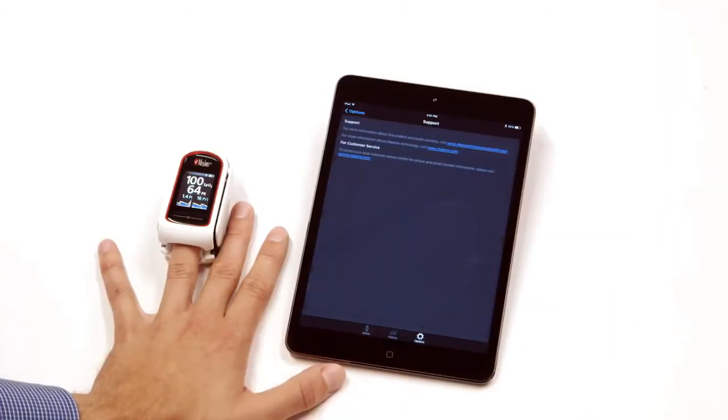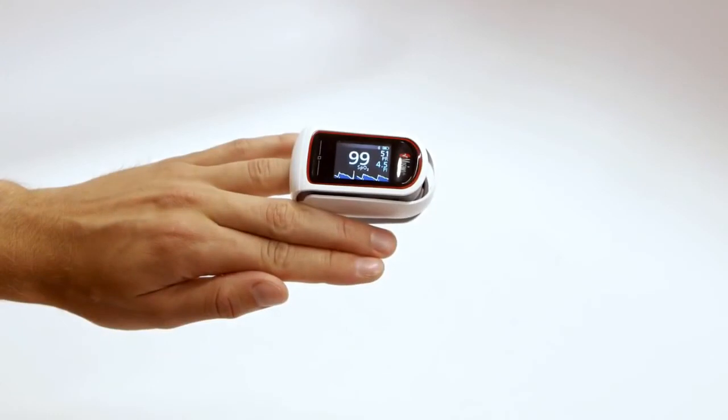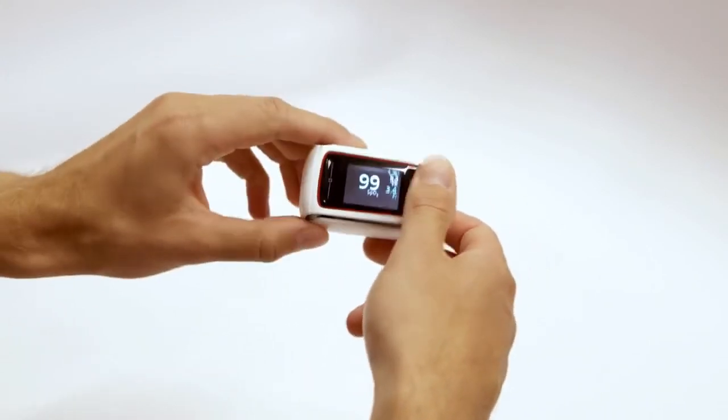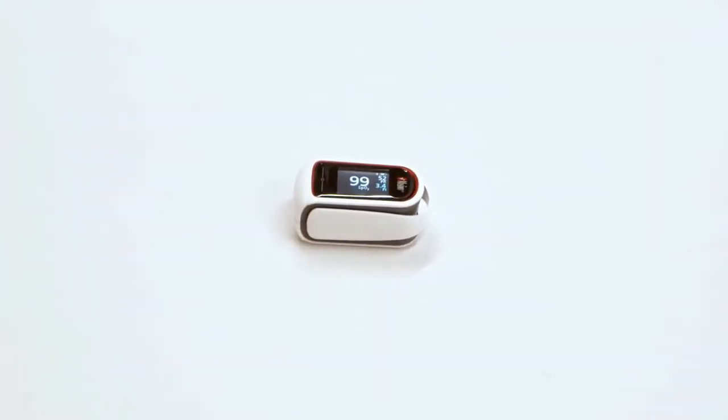For more information about the product and pulse oximetry, visit www.massimoprofessionalhealth.com. For more information about Masimo technology, visit www.masimo.com. For customer service and to locate your local customer service center for phone and email contact information, visit www.masimo.com. MightySatRx automatically turns off after removing the finger from the device and after deactivating the Bluetooth connection.